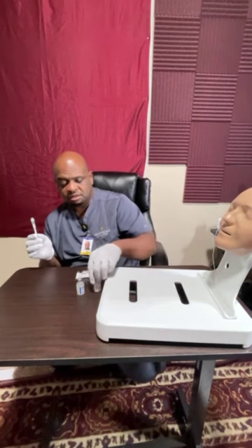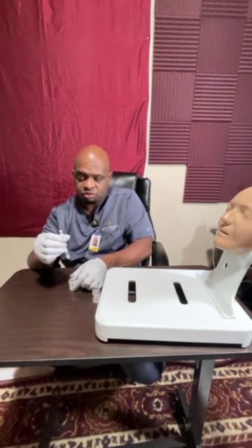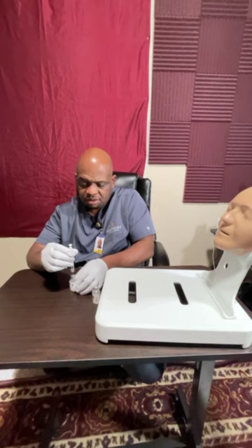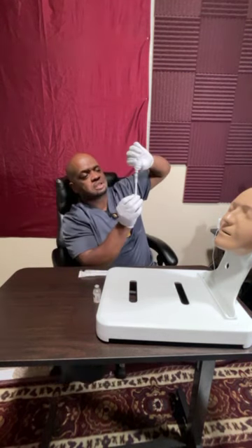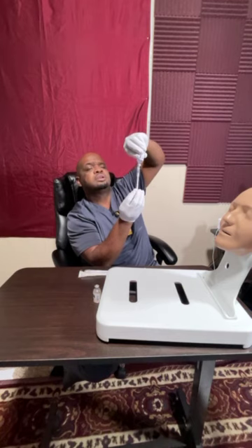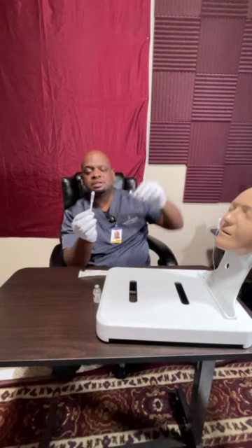The next one, for the NPH, we are going to now draw up. Oh, my battery. Please tell me it's still recording. Good. All right. So for the NPH, we're going to draw up 8 units of NPH, making it a total of 12. We're going to turn it upside down, and we are going to draw up the additional 8 units, making it a total of 12. Let's get to 10 and 12. There we are. There's 12 units.